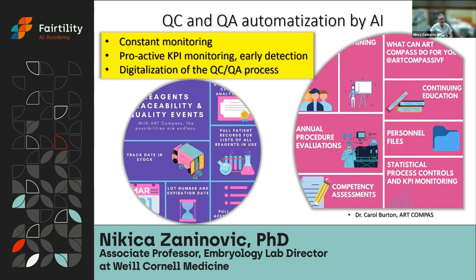So what we are trying to achieve is that AI is going to tell us preemptively what problems can occur with any of these particular instruments. It's going to tell us way in advance when some machines are, let's say, drifting, when the temperature is drifting down slowly. We don't want to wait for the problem. We actually want to have this preemptive system that is going to tell us, oh, you know, this machine might be going bad. You need to do something about it.